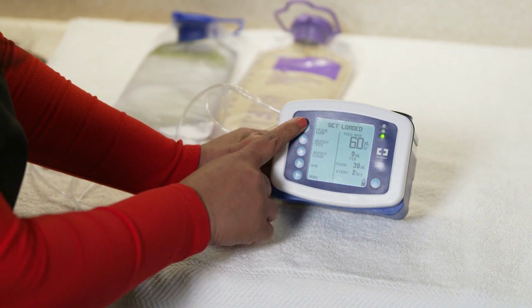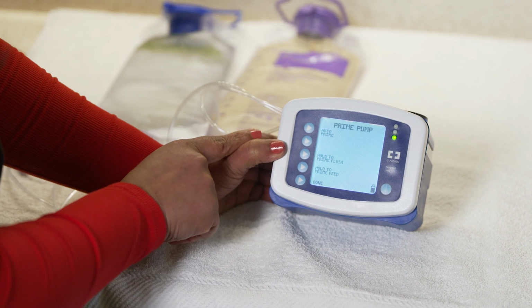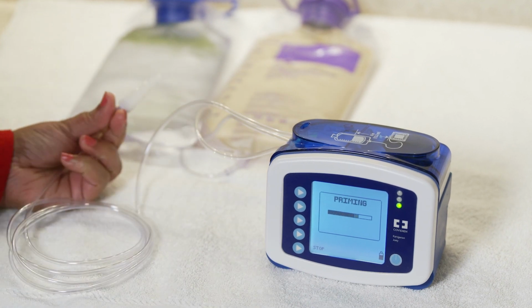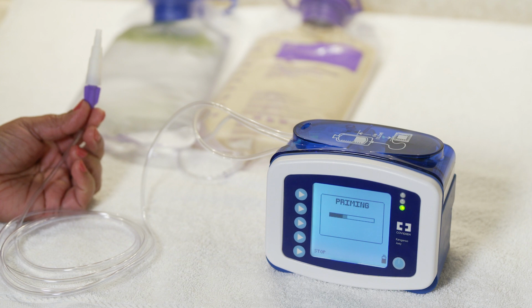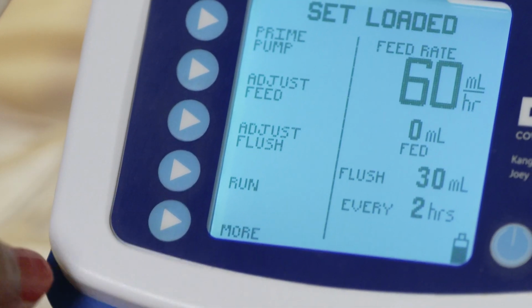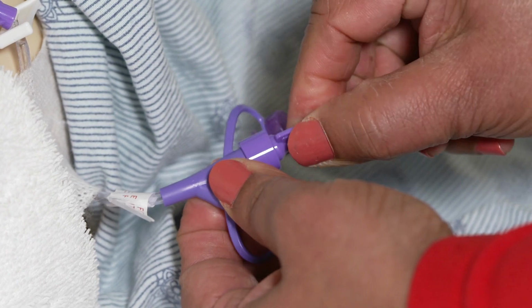Now you will prime the pump to remove air from the tubing. Press the Prime Pump button on the menu selection. Press Auto Prime. Remove the cap from the end of tube before priming the tube. If you still see extra air inside the tube, press the Hold to Prime Flush button. Press Done. Next, securely connect the prepared feeding bag to the J-tube.